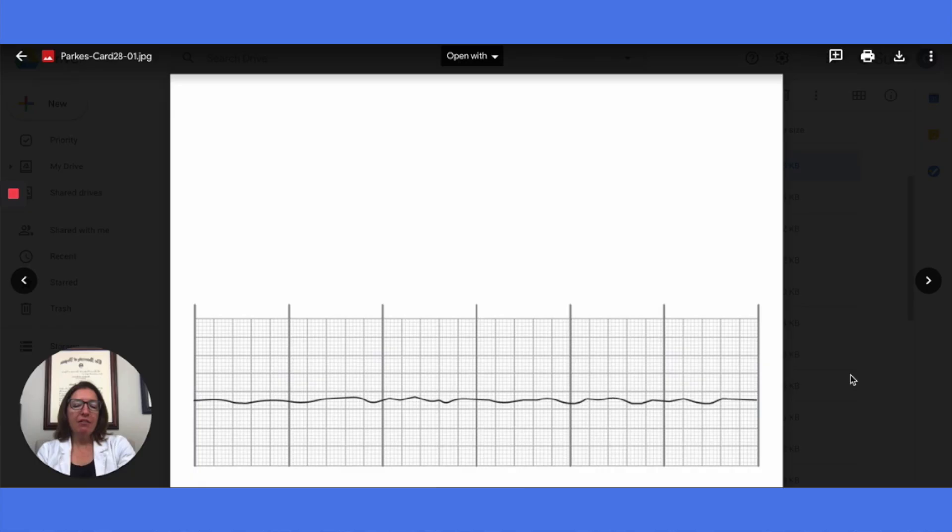Finally here we have asystole. This is the rhythm you never want to see on your patient, but you always want to see on your exam because it's pretty easy to pick out. This is asystole. The heart rate is zero. There's no atrial or ventricular heart rhythm. There's no P wave. There's no QRS complex. You will need to perform CPR on a patient with asystole pronto.